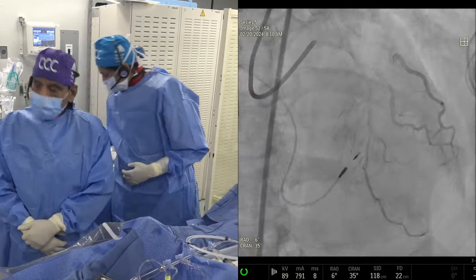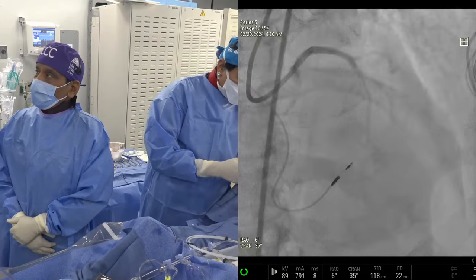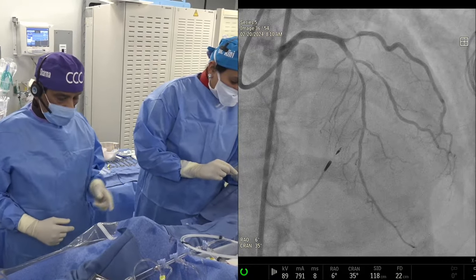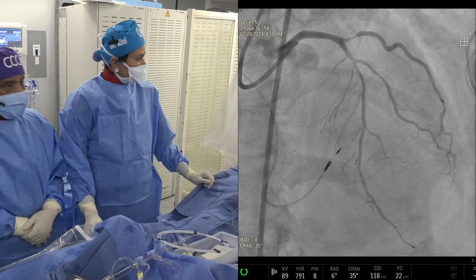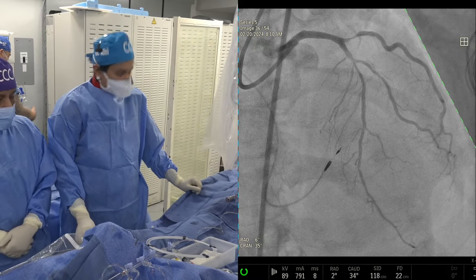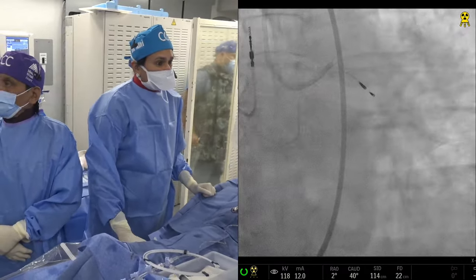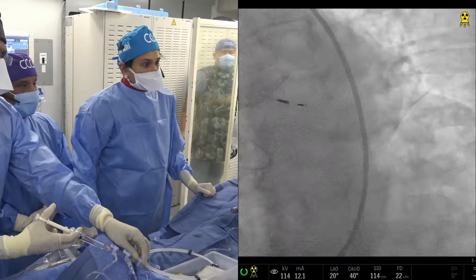I think I would just go angiographically, balloon stent. It looks to me like it could be a severe calcium in that area. Because remember, it's very hazy. Should we take one more picture? Caudal? And we can ask our audience also what they feel in this particular case. Because anytime you see a hazy appearance, one, it will be an eccentric lesion. And secondly, it's either thrombus or calcium. And this is a stable case, so the thrombus is unlikely. So calcium is one of the diagnoses.